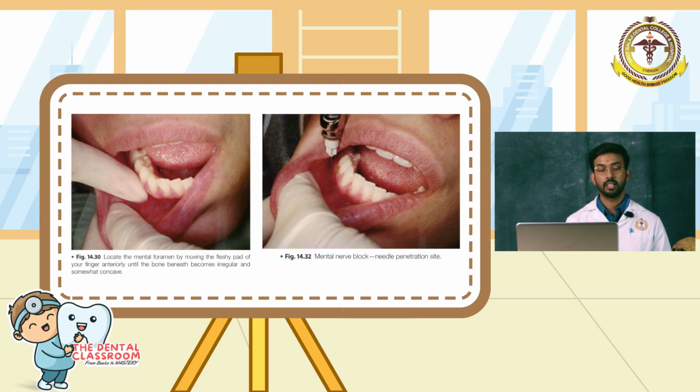So, how do we locate the mental foramen intraorally? We keep our finger pushed inside the vestibule and run it along from the first molar region anteriorly. We might find some roughness, concavity or depression over the mental foramen region. Typically, the mental foramen presents just apical to the mandibular second premolar, or between the apices of the mandibular first and second premolars. Once the mental foramen is located, we can proceed with the technique.